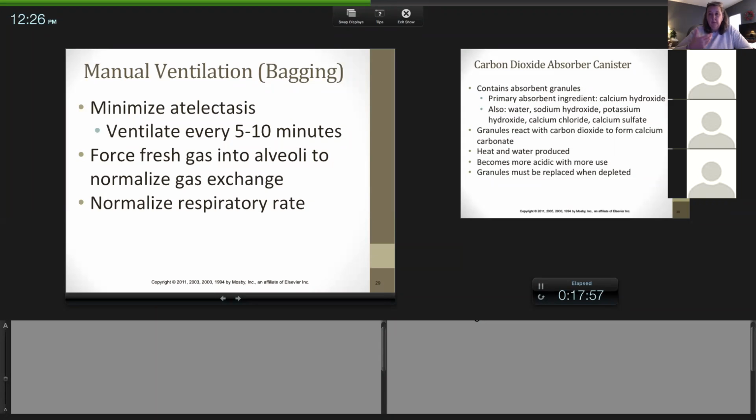And you can have an animal that's ventilating normally because it could be a blood flow issue. It could be a blood pressure issue. It could be an anemia issue. So there are reasons that SpO2 can be off that have nothing to do with how well they're breathing. Does that make sense, James? So you're right to say, if I have a bad SpO2, I probably need to bag my patient.